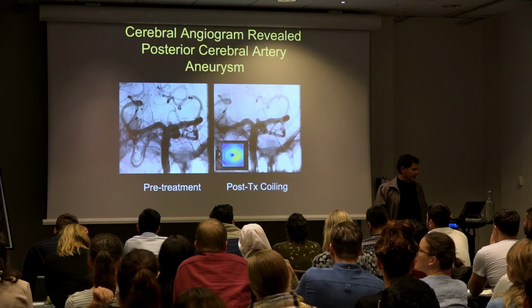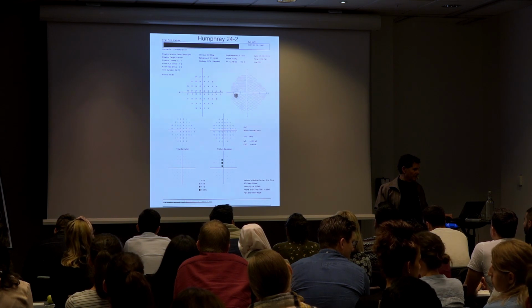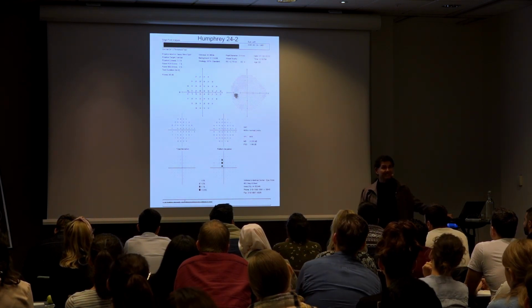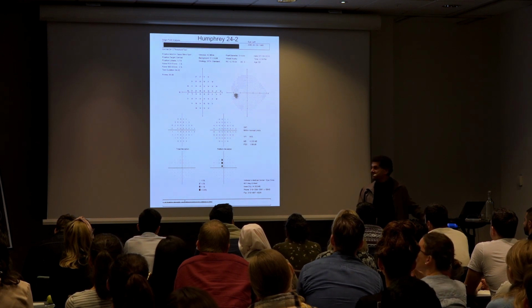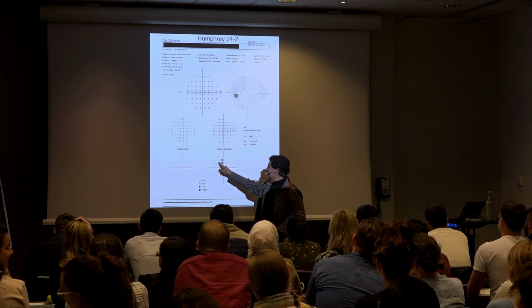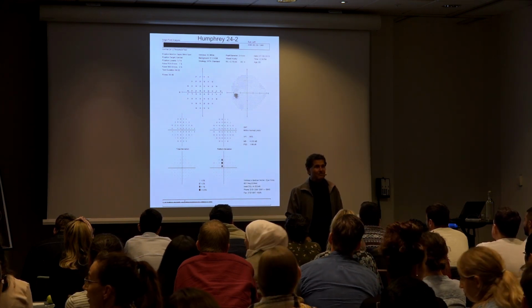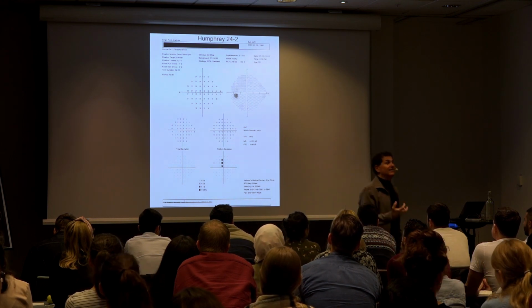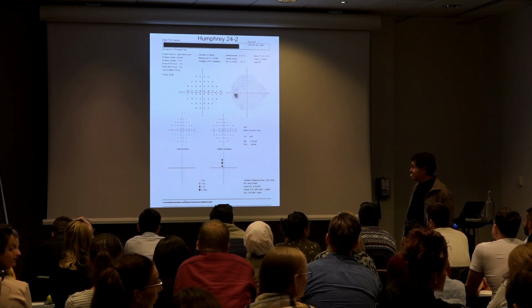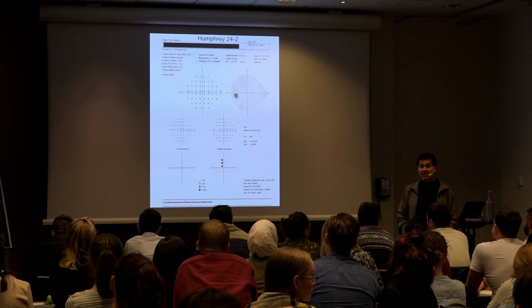Well, let's go back for just a second to the first visual field. In retrospect, we call it unspecific. But now if you start looking at it, you've got a cluster of points here that maybe we weren't really noticing, but I guess the OCT drew our attention to that. Because when you repeat this, it was not the same again. It comes and goes some, exactly.